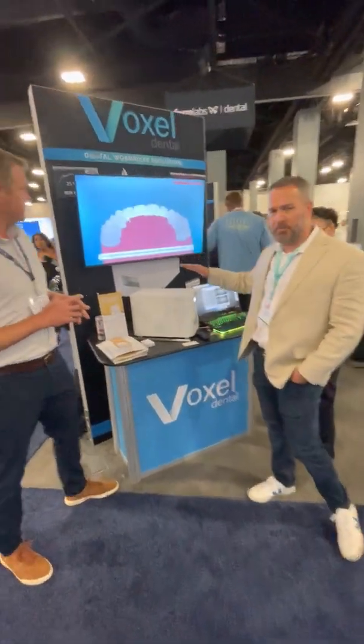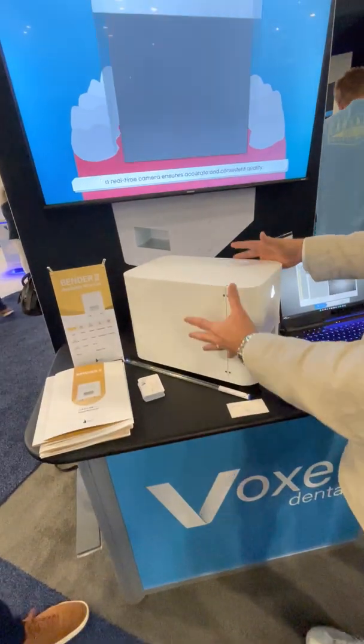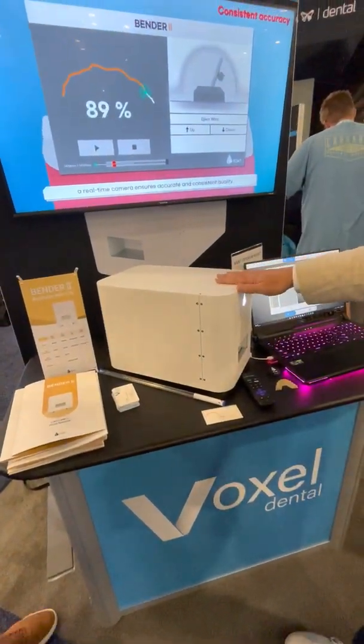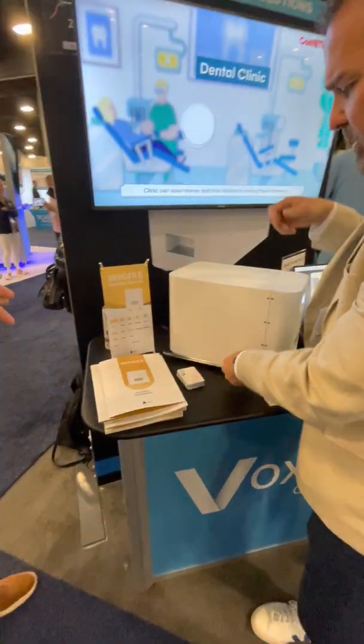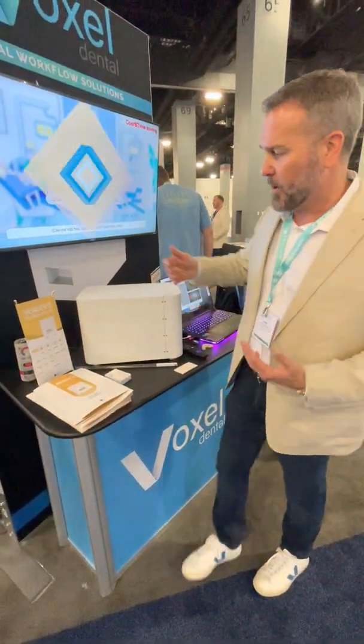We're super excited to introduce the Bender 2 to the orthodontic market. As you can see, it's a really small form factor — can just sit on any table in the practice. Very simple as how it works. You're going to use straight wires; you can do braided or smooth and round, rectangular or square, and they feed through the back of the machine.